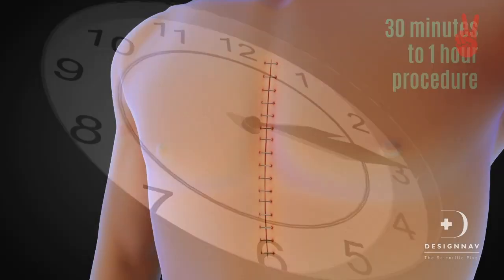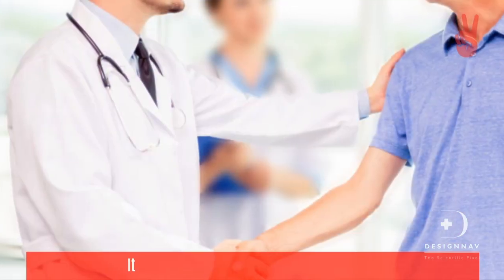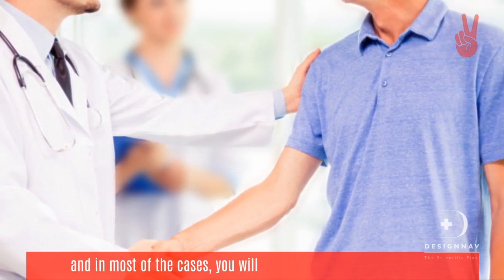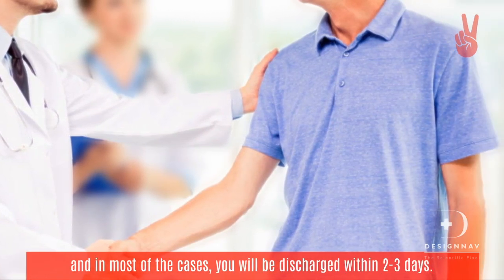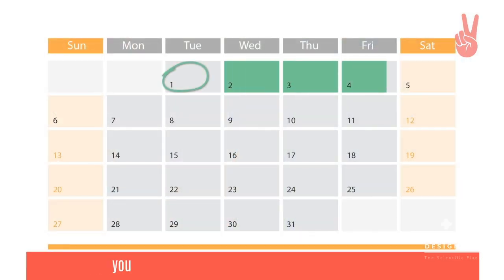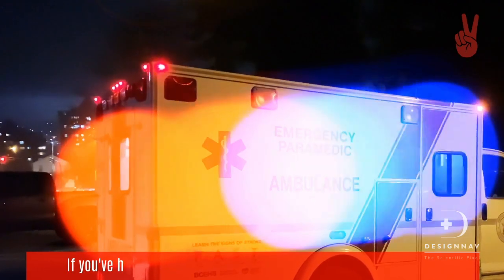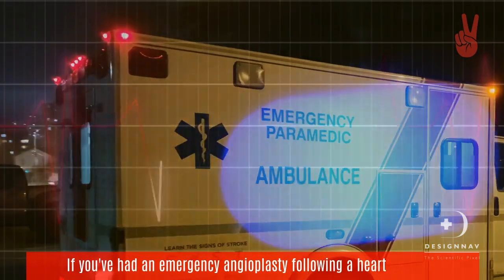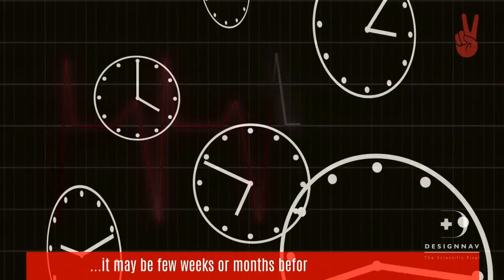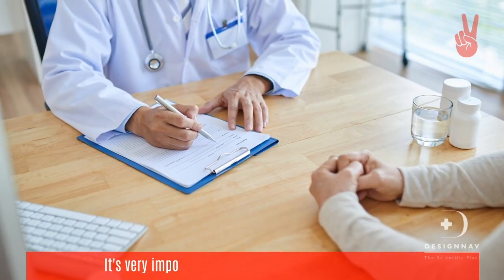As the procedure doesn't involve making major incisions in the body, it's usually carried out safely in most people, and in most cases, you will be discharged within 2 to 3 days. If you had planned non-emergency coronary angioplasty, you should be able to return to work after a week. However, if you had an emergency angioplasty following a heart attack, it may be a few weeks or months before you recover fully and are able to return to work.